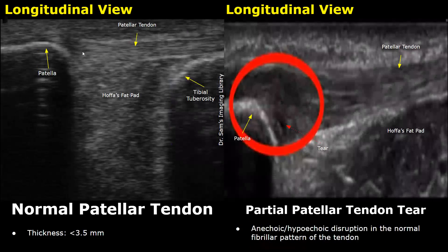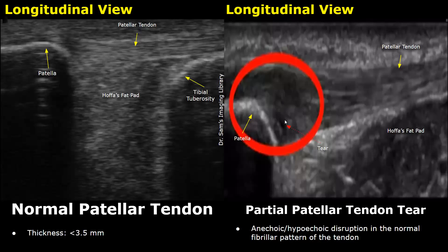In this image we can see a partial patellar tendon tear at this location. You can see the disruption in the normal fibrillar pattern — this is a partial tear.